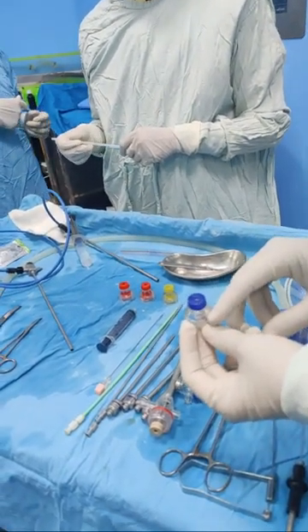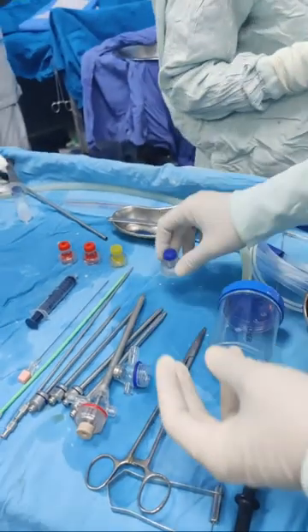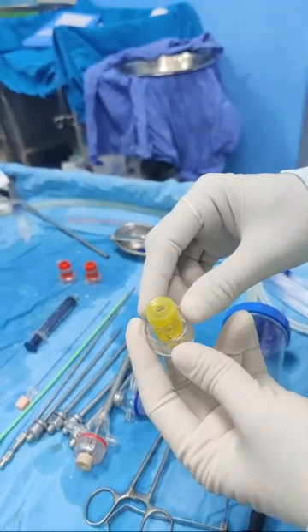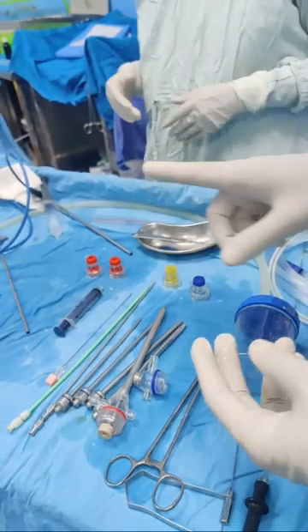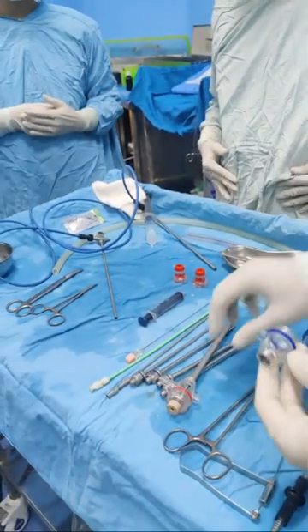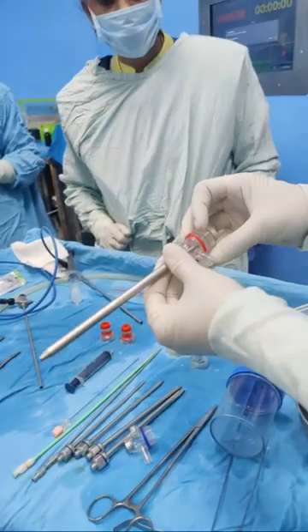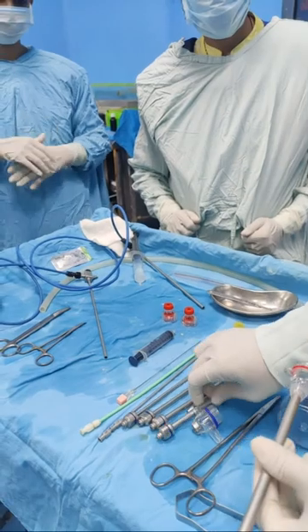When it is written M, it is for the mini PCNL size instruments. When it is written L, it is for a scope between 16 to 18 French or something like this. And when it is written XL, it is for the 21 French nephroscope. Now this suction master is common for all. In one of the designs, the suction master is fixed; you can see it is affixed to the sheath. In another design, it is separate.